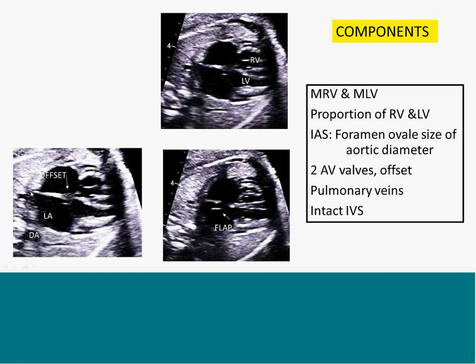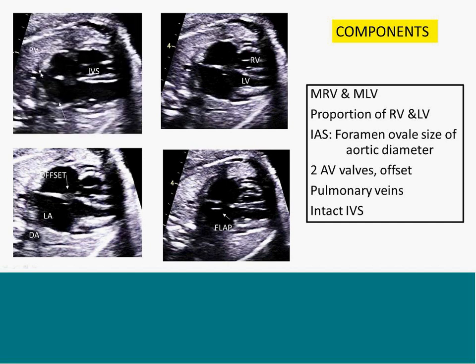Important thing is the pulmonary veins inside the left atrium and the descending aorta which lies behind the left atrium. The left atrium should be like pulled ears. It should not be blunt. Like pulled ears. You can see here the left atrium is like pulled ears. And there's no distance between the descending aorta and the left atrium.